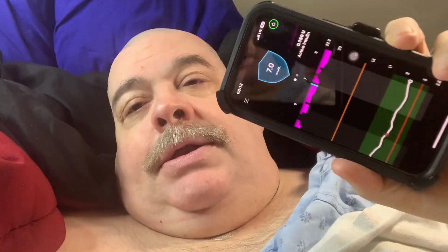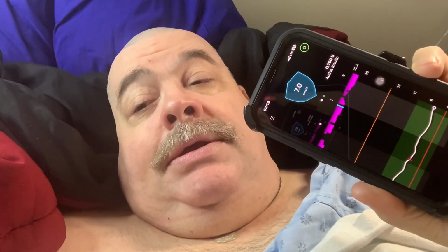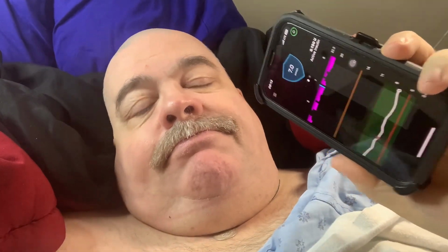Next, you have to wear another device. If you're on a Dexcom, for example, you have to have another receiver close by. Even with Omnipod, I believe the new Omnipod is integrated, but you have your site, and then you have your sensor put in.